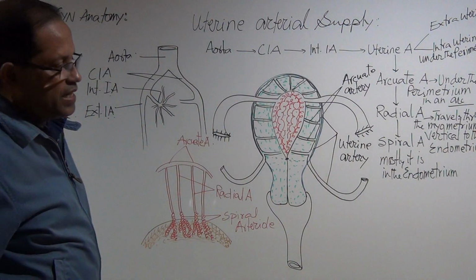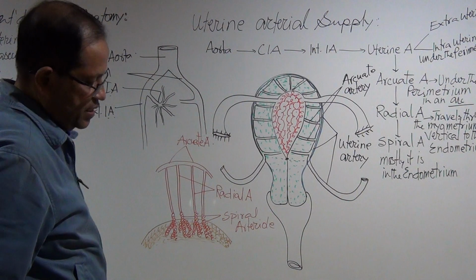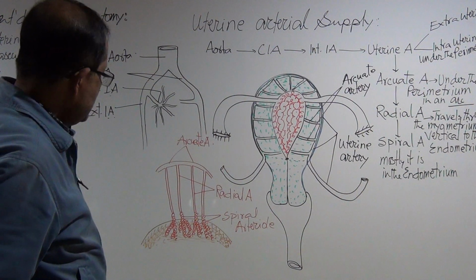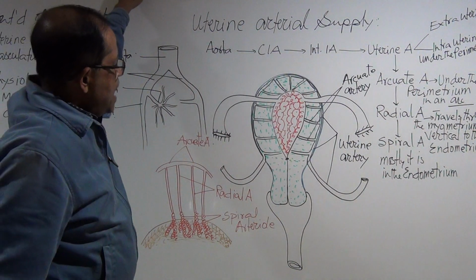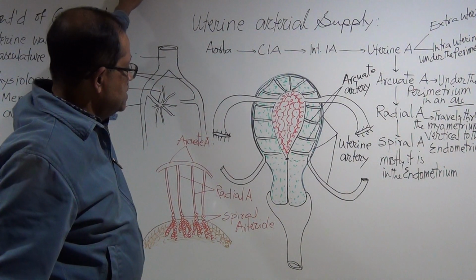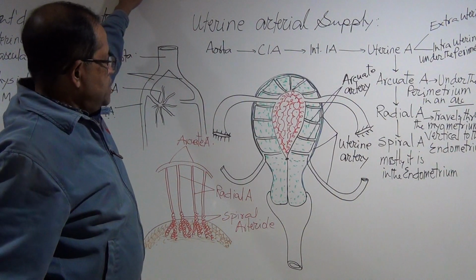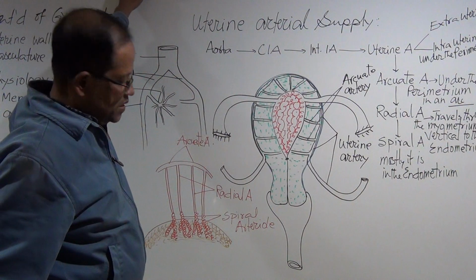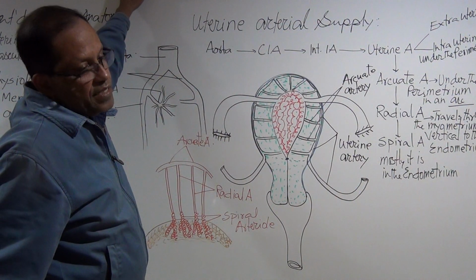We can also click the power Doppler to see the vascularity. Okay, it is very important to evaluate the arterial supply and its resistivity index for the uterus during its different phases to evaluate the fertility.